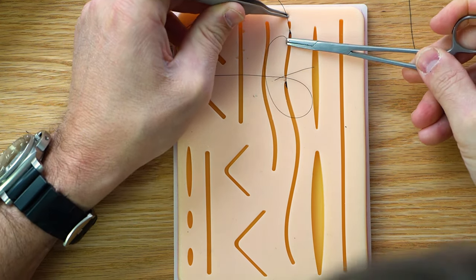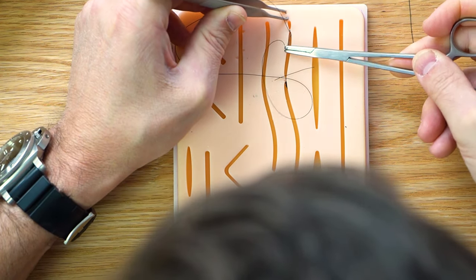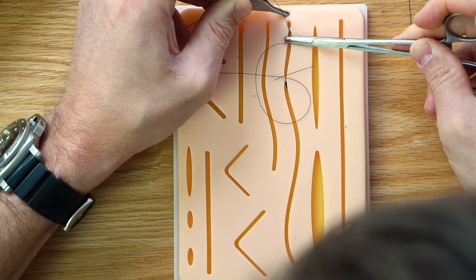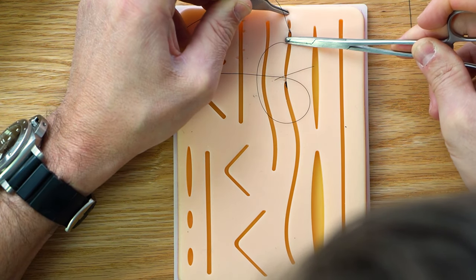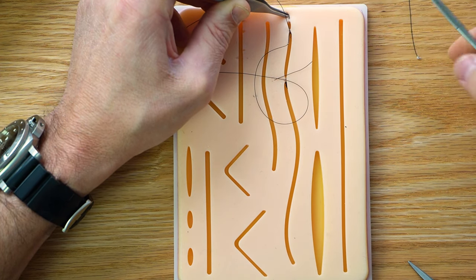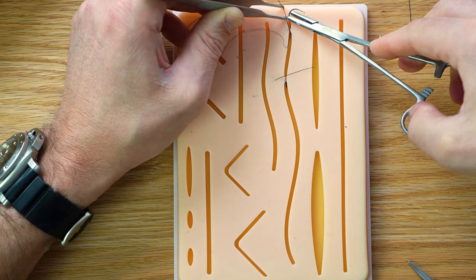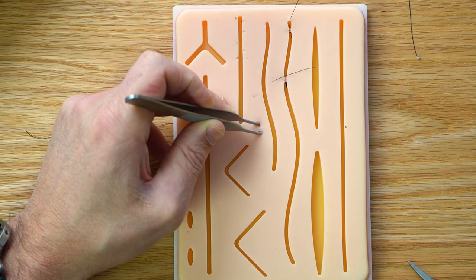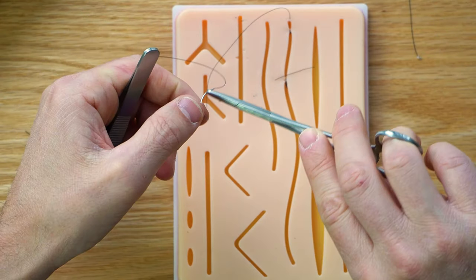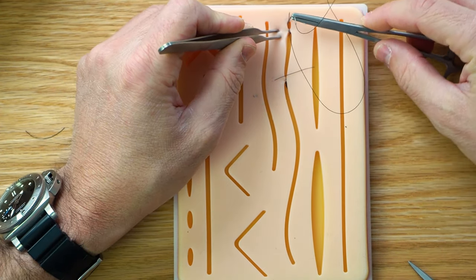And so then I'll come out the apex, but this is still in the dermis of this skin, and so this is not coming out right. So I'm gonna demonstrate it by just coming out this way. But essentially you would come out of the dermis, but the rubber just is not allowing me to do it, so that way you're starting in the corner. This is one way to do this. So imagine this is in the dermis, okay? Then I'm gonna come this way.